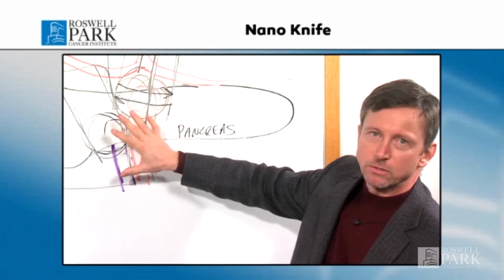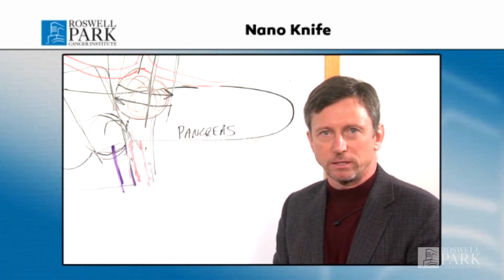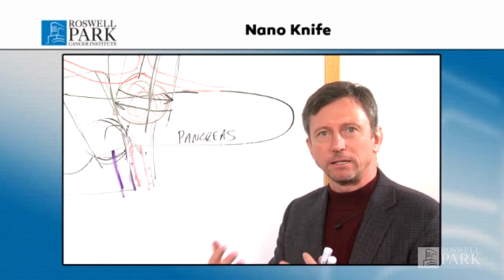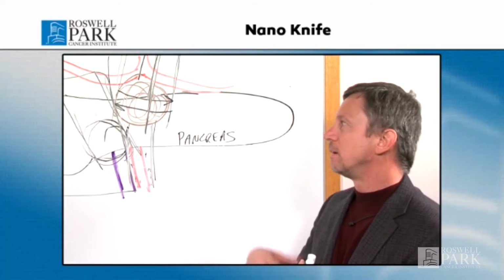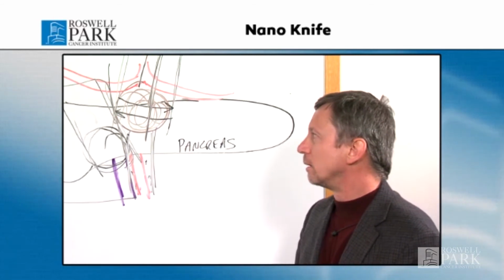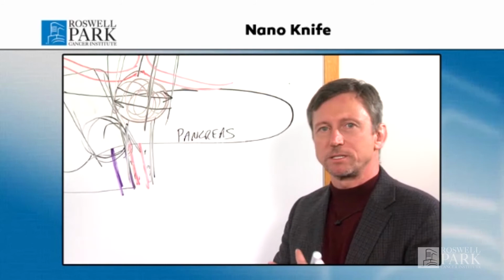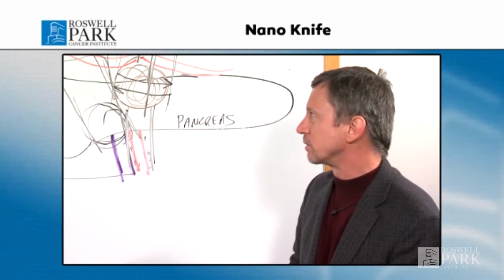We will definitely do the NanoKnife in conjunction with chemotherapy, and we may do it in conjunction with radiation therapy as well. So I'm not recommending it as a standalone procedure. It should be done in cooperation with a medical oncologist, possibly a radiation oncologist, and it's part of our multidisciplinary care philosophy that we have here at Roswell Park. So this would be a team approach, and this would just be one of the treatments that would be recommended in addition to chemotherapy and radiation therapy as well.